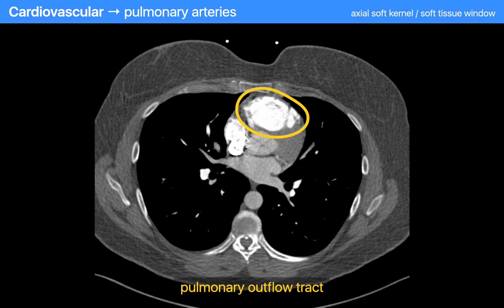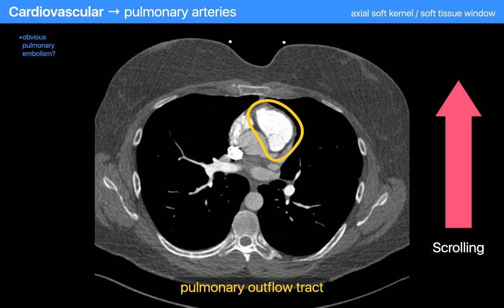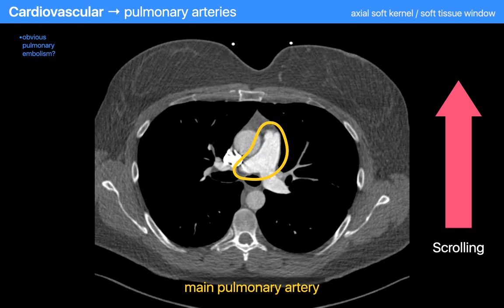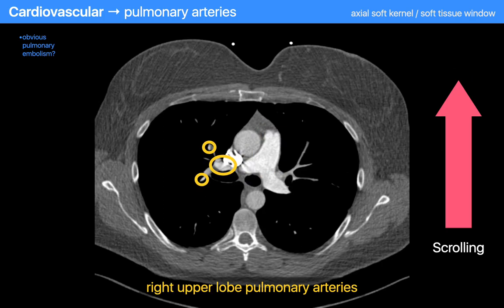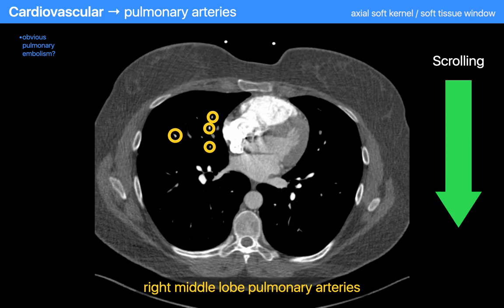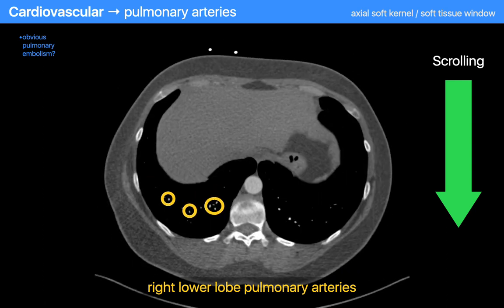Next, I begin my review of the pulmonary outflow tract and the pulmonary arteries. On a non-contrast study, I'm basically just inspecting their size, while if there's contrast on board, I'm also looking for thrombus and other filling defects. I do my best to inspect the pulmonary arteries in each lobe, one lobe at a time, working from center to peripheral and then back to center again.